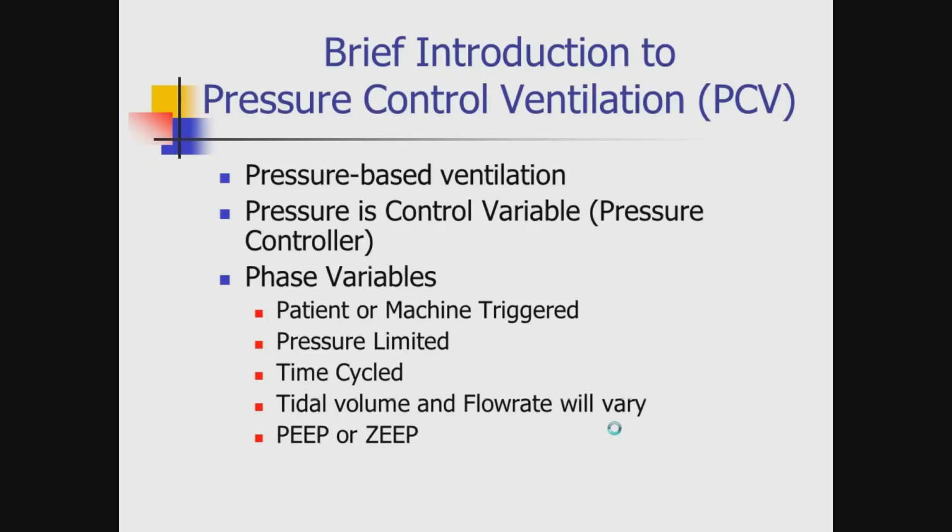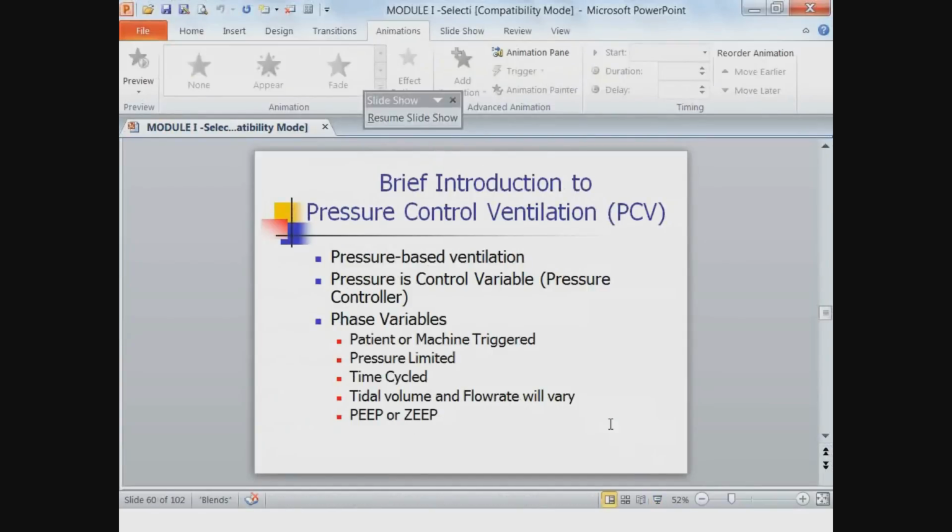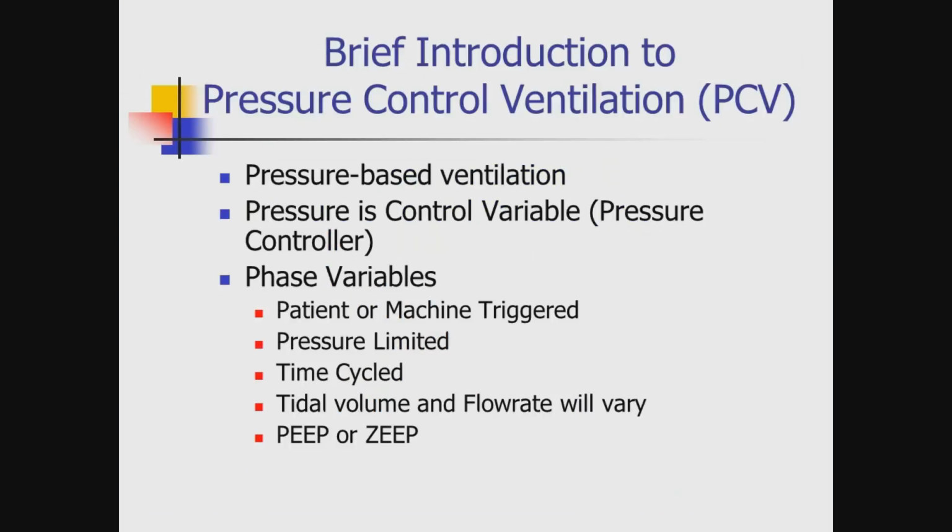All right, let me go ahead and just briefly go back through pressure-based ventilation. Some of this is a little bit of an older lecture that I could probably delete, but I don't think it ever hurts to continue to go through this.